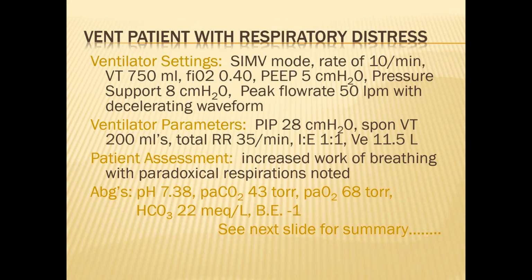Okay. All right, so more pressure support is needed, right? To get some bigger tidal volumes in there. If you have a bigger tidal volume, does that slow down the respiratory rate?